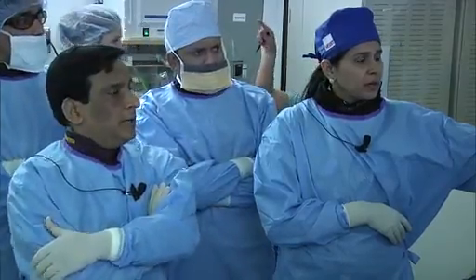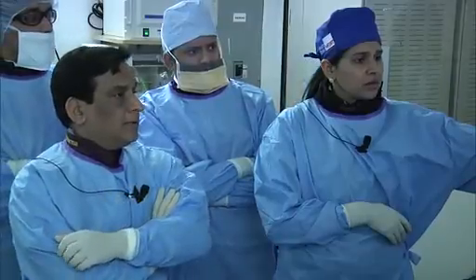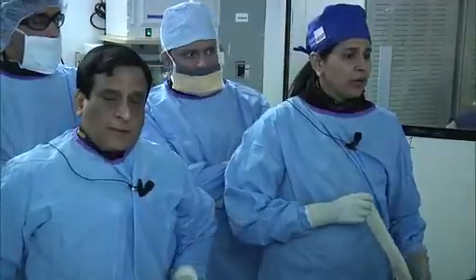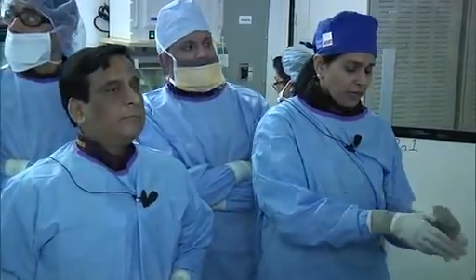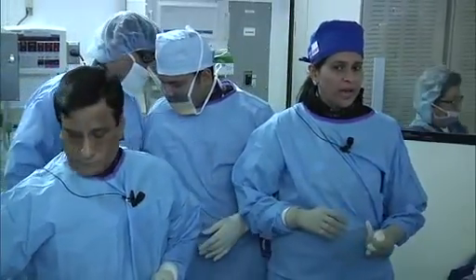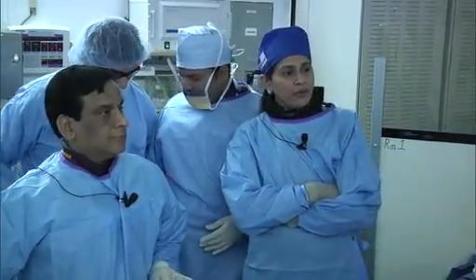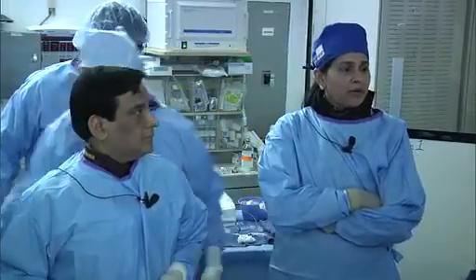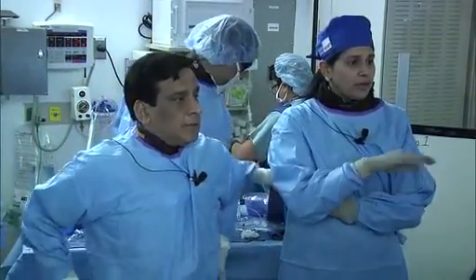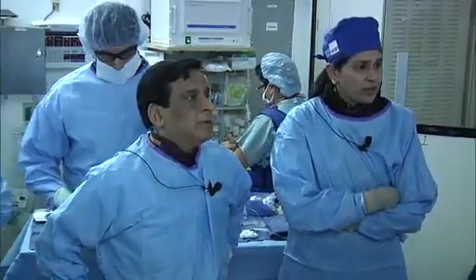Anu, your final thoughts on the case? Yeah, the case is an angiogram. I think what was important was how you would tackle it if you have multiple branches and a distal vessel. I think just focus on one of the branches. That's what we did, we focused on the PDA, we have a nice result of the PDA and just a nice balloon result of the RV branch, everything is okay.